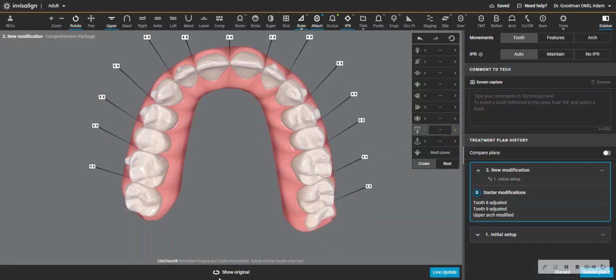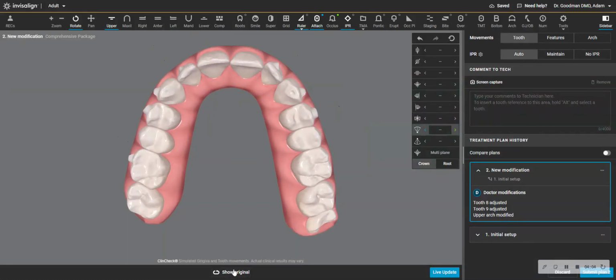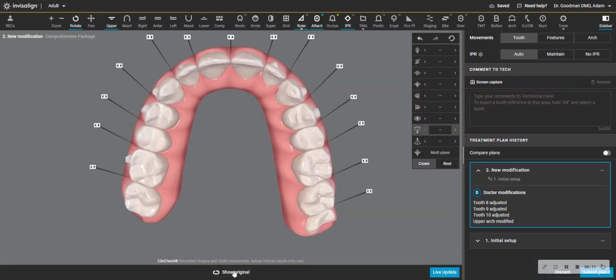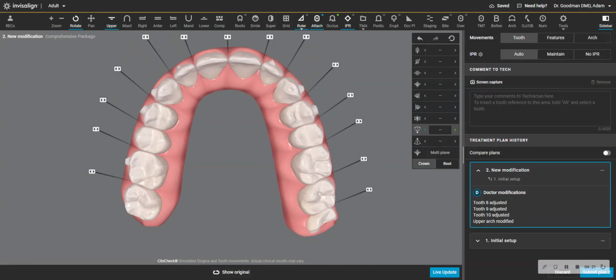Now you see how the central is coming forward in a tipping motion. I still have lingual root torque here that I don't want. So now I'm getting some alignment of the front teeth. I'm also going to take this out over here. I'm not really adding buccal root torque. I'm just putting the teeth at the root torque where they're at the start of the treatment. Now, I'm getting a little intrusion and I'm getting a little alignment.